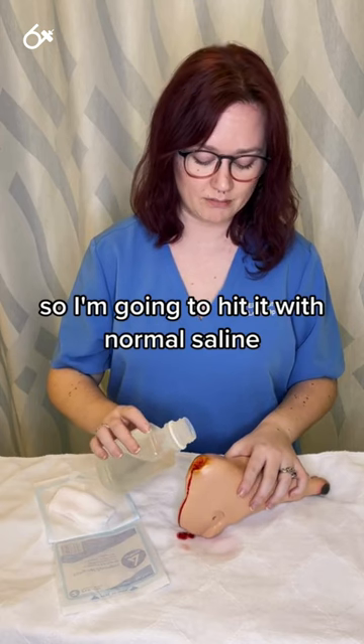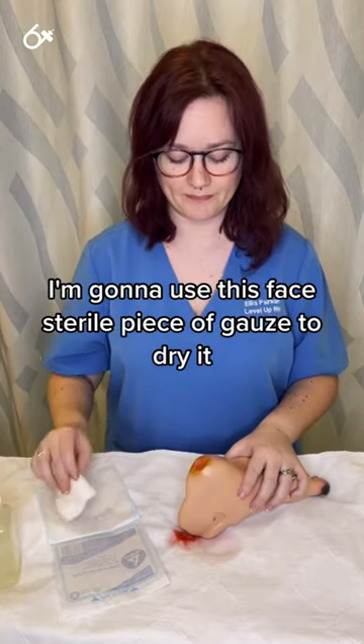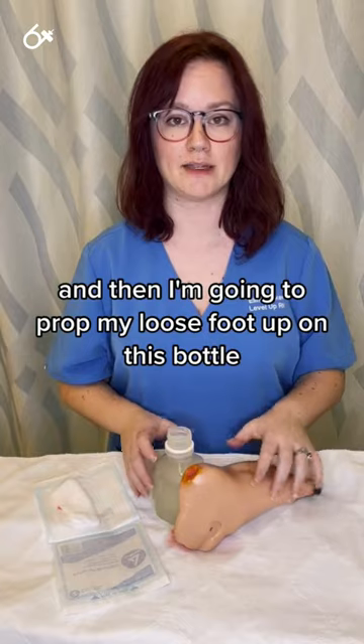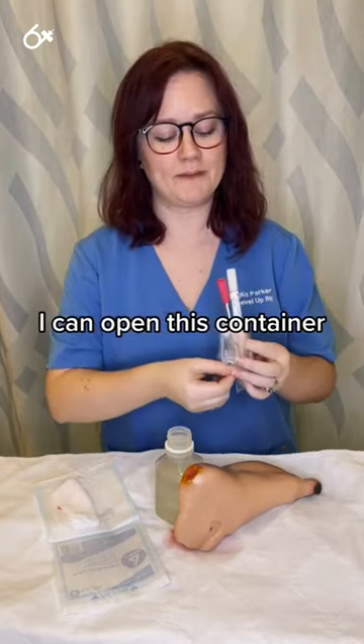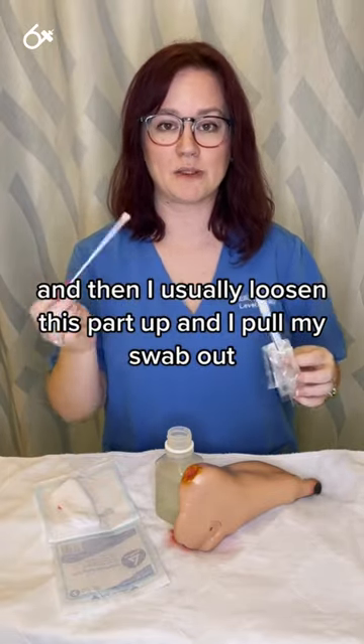I'm going to irrigate it with normal saline, then use this sterile piece of gauze to dry it, and then prop my patient's foot up on this bottle. When I get the swab, I open the container, loosen this part, and pull the swab out.